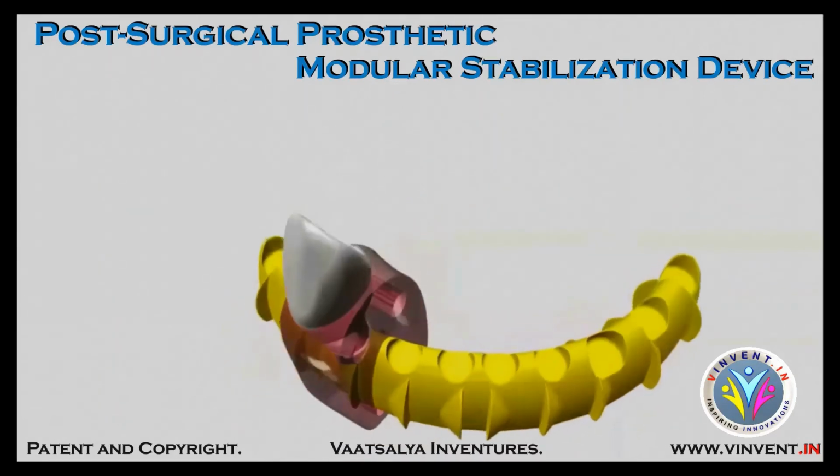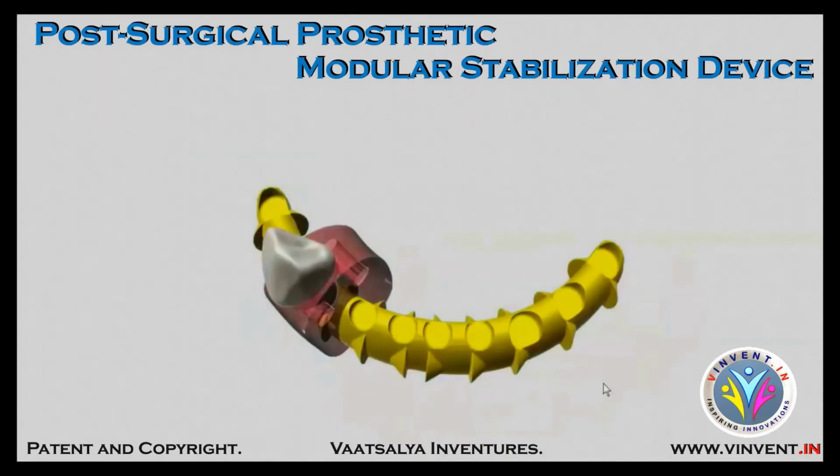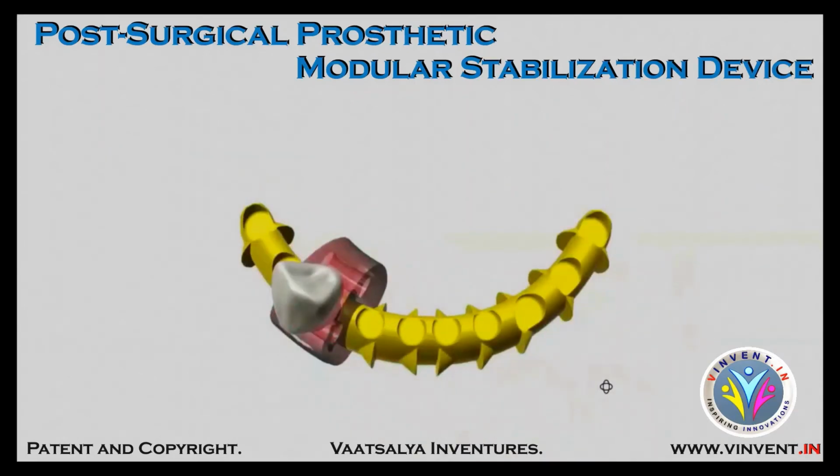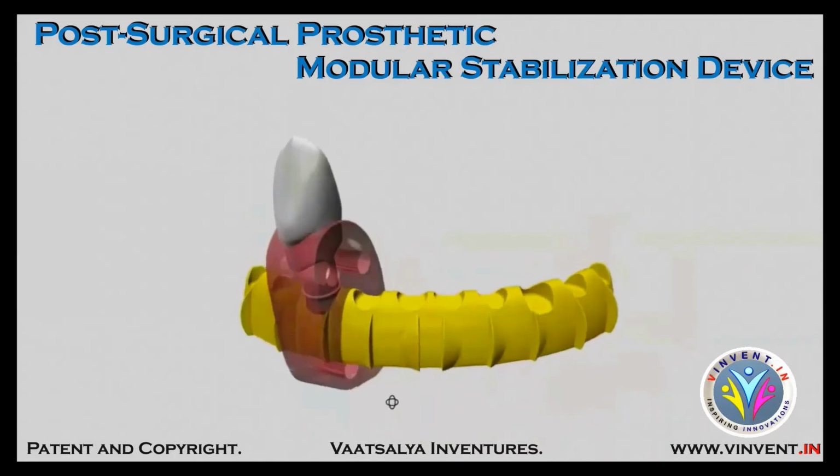To better understand the relation between these components, we must understand their features and how they relate to each other. For the purpose of this explanation, we will use individual soft tissue component and the tooth component of tooth number 43 placed on its respective position in the internal spine.